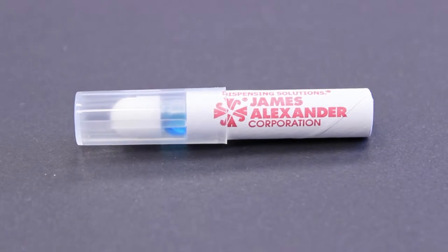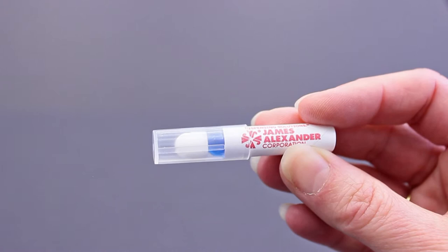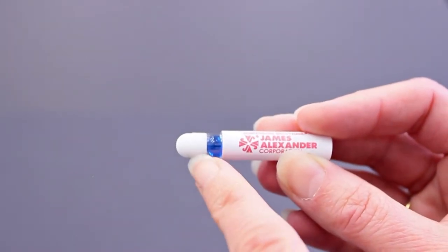James Alexander's glass swab packages are available in a variety of sizes with assorted tips. The glass swab package can be filled with any non-viscous solution for topical use. The package contains a clear over cap with a glass ampoule inside a butyrate tube.